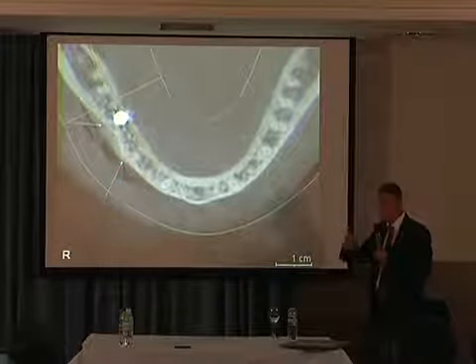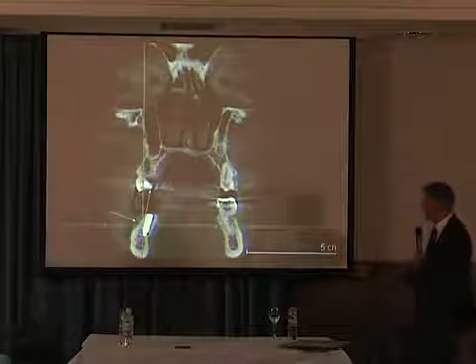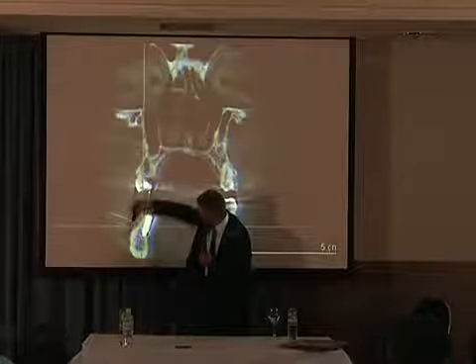Implant position lingual, enough bone, enough keratinized tissue. This is the PRGF stable.